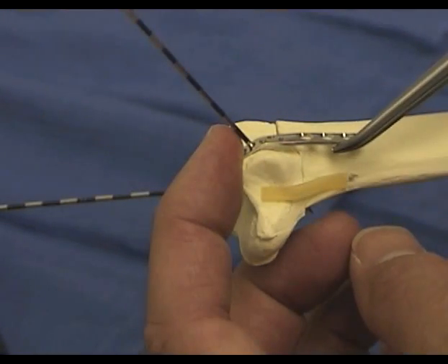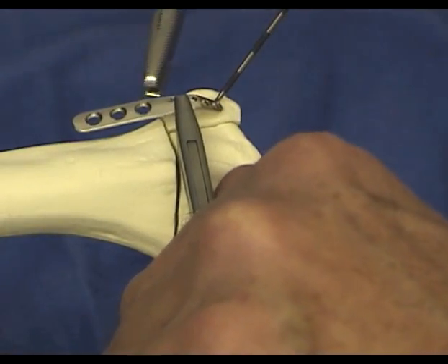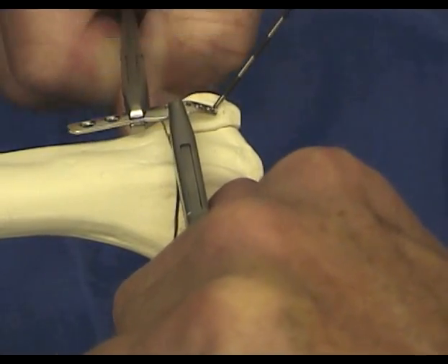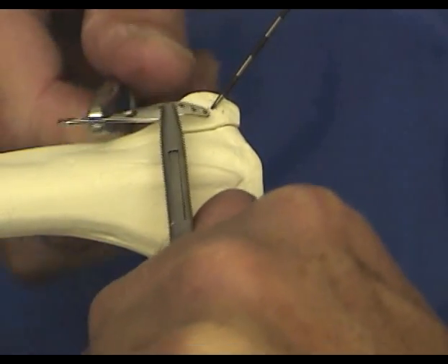Because of left and right differences, an additional twist is required to contour the ulnar edge of the plate to the bone. A gradual 15-degree torsional bend is made over the proximal part of the plate using two pin clamps to contour the plate properly to the left or right arm.